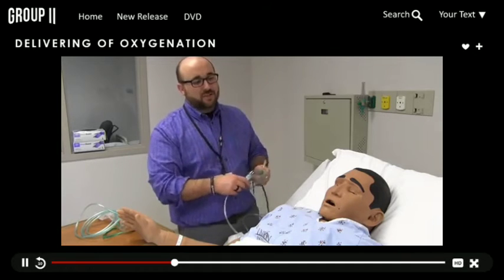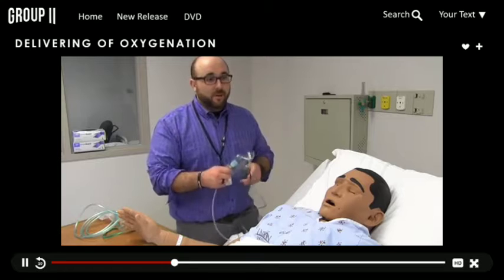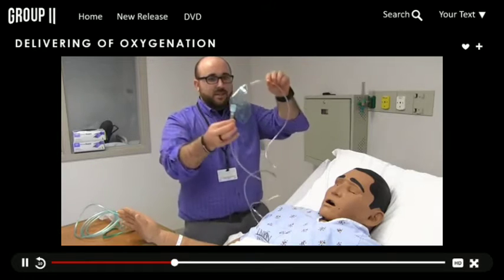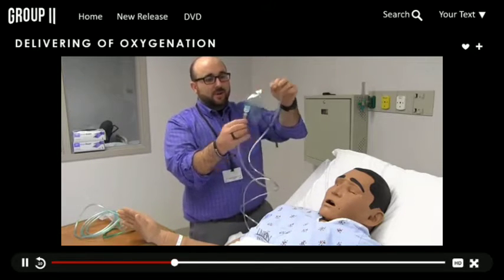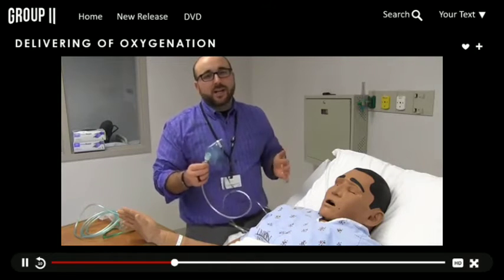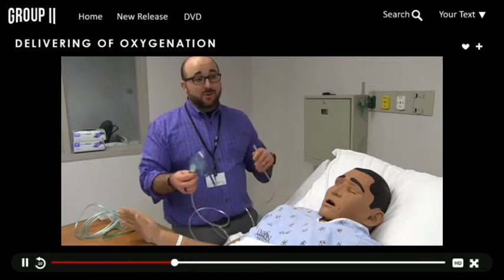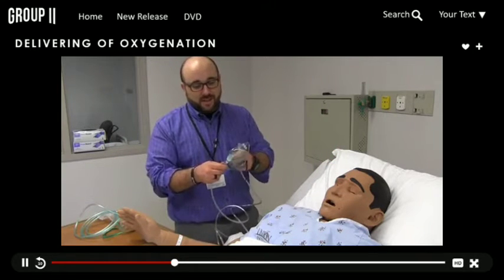So we're just going to throw some oxygen at this patient. You know, maybe their saturation will come up, maybe they'll feel a little bit better. But with this device, as you see, it's a mask, it has a little adapter on it, it all comes together. It's going to deliver anywhere from like 40 to 60%. Now that's a broad range, so it's nothing that we're going to use when we're weaning oxygen or anything like that.